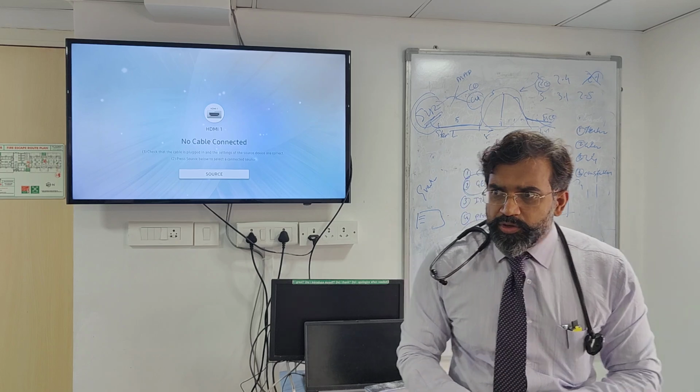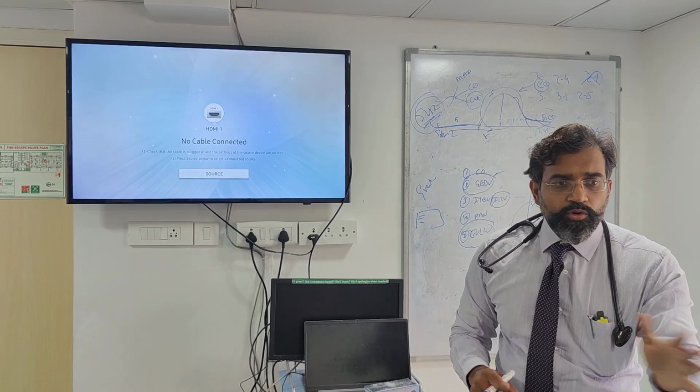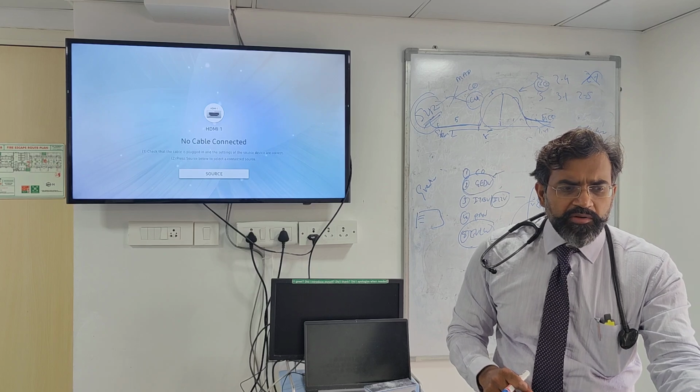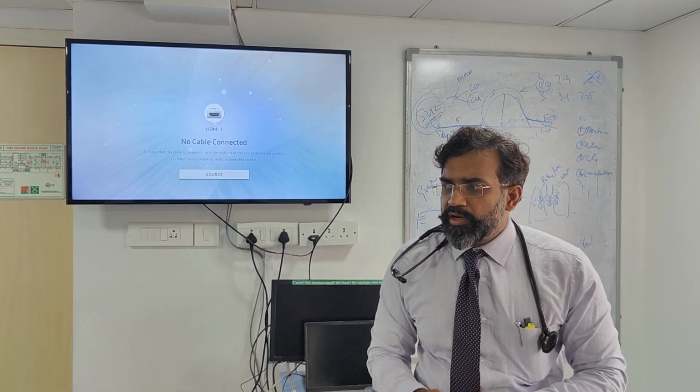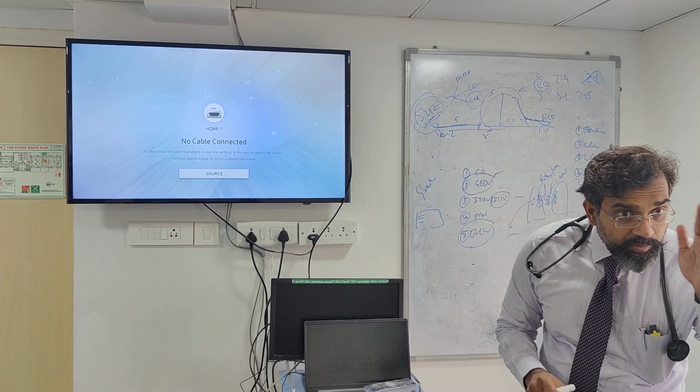You cannot look at one value and say, this is what it is. No. I am looking at everything together and saying, okay, this GEDV is also low. It's 200. Maybe this is a problem. Let me find out what's happening here. You understand? That's how I'm going to interpret my GEDV.